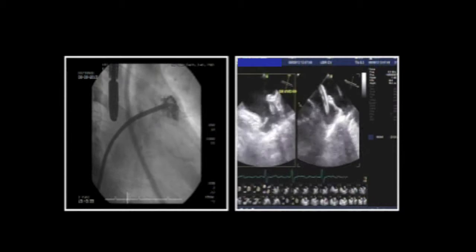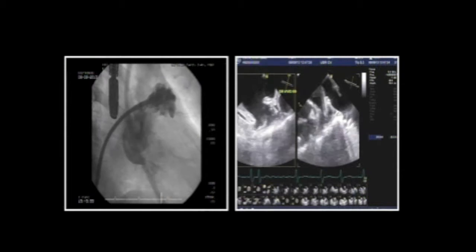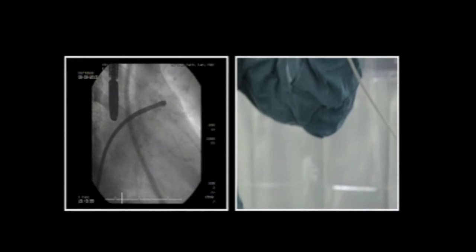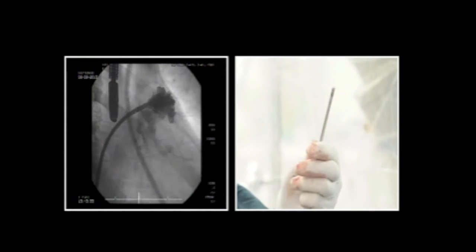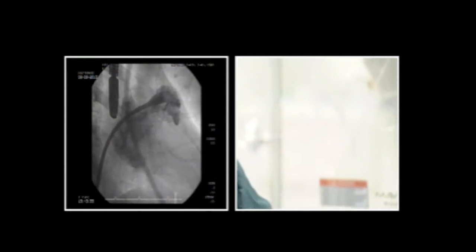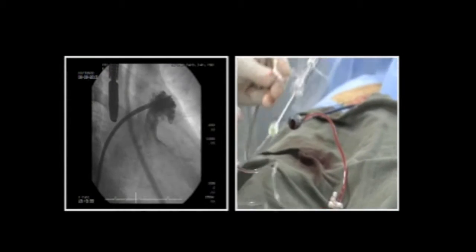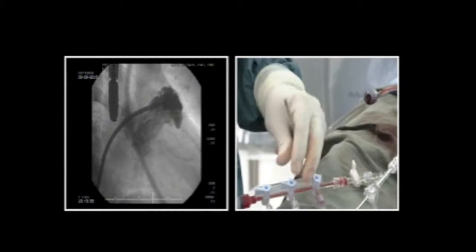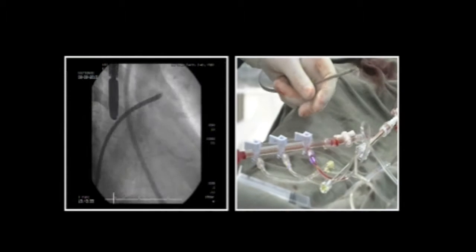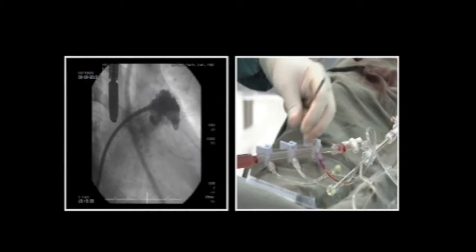As I said, it comes preloaded, so I cannot show you the device. I have to de-air this. And the best way to do it is to inject saline slowly until it comes out distally. Okay. Now I will connect the manifold to the side arm of the delivery system, because when the delivery system is inside of the sheath, I cannot inject anymore. I can inject only through the delivery catheter, not through the sheath.